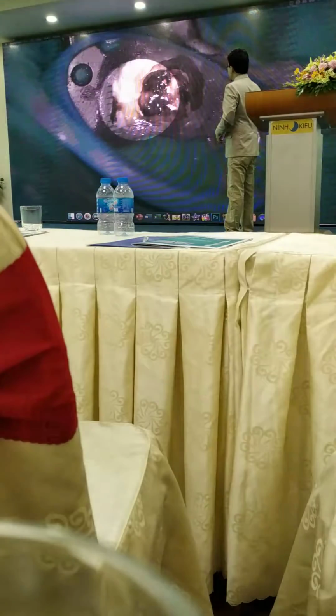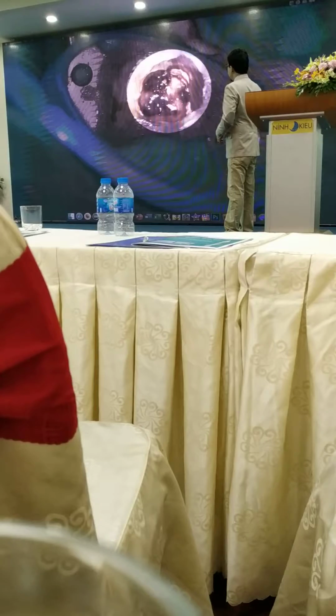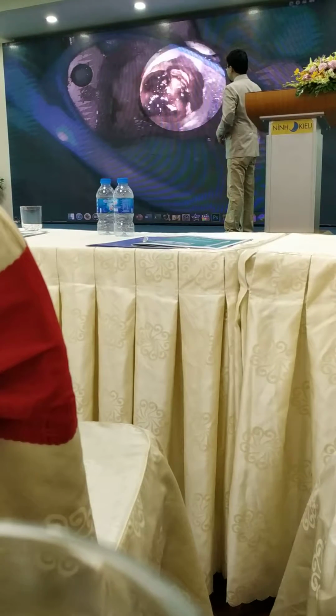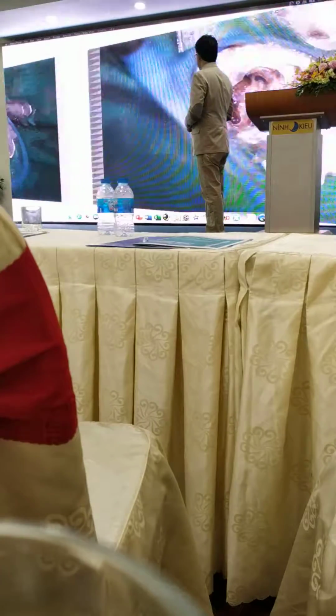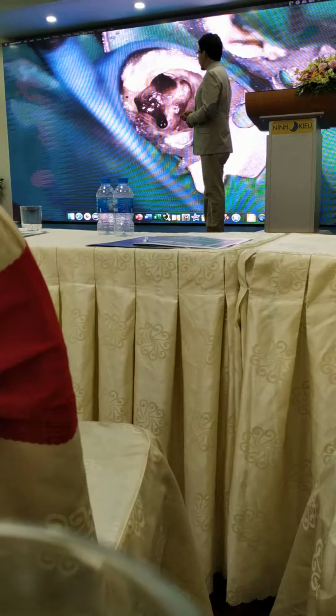As you can see, the doctor that performed the first treatment removed a lot of dentinal structure here inside. In the X-ray, it was impossible to see that. I proceeded to locate the canals and to shape the canals.